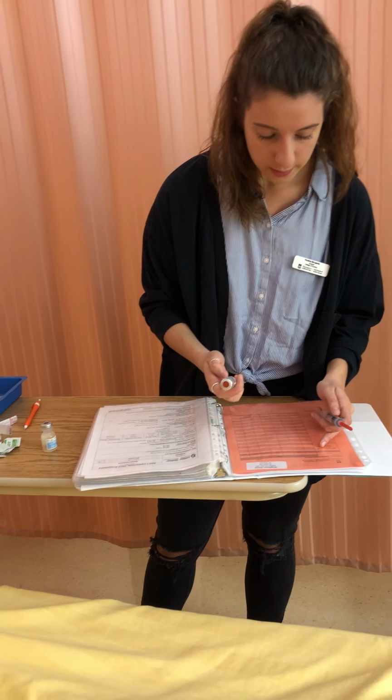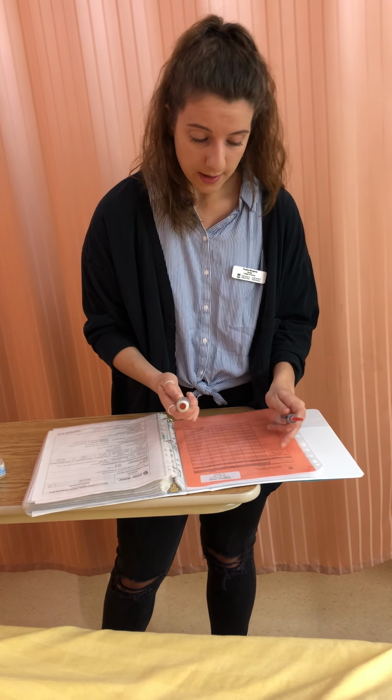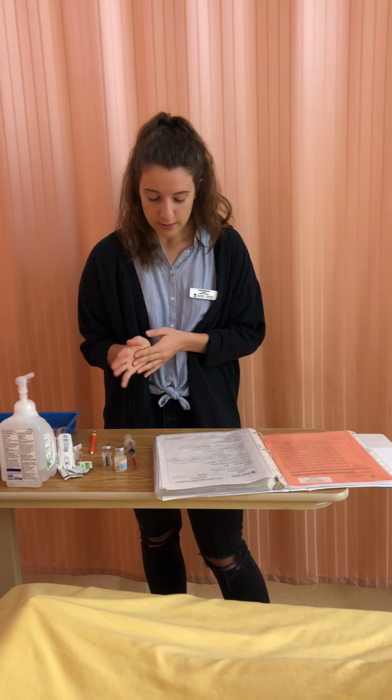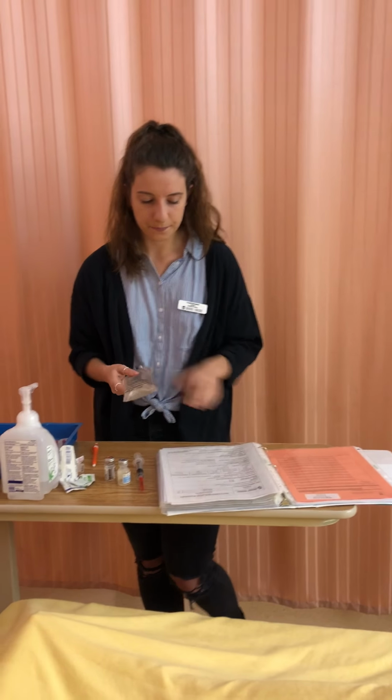The right dose is 400 milligrams, which is 4 mLs, which is in my syringe, and I got from my 500 milligram vial. The right route is IV, this will be given IV, and the right time is daily, or 0900, which is now. So now I can further dilute my medication into my mini bag that I have chosen here.